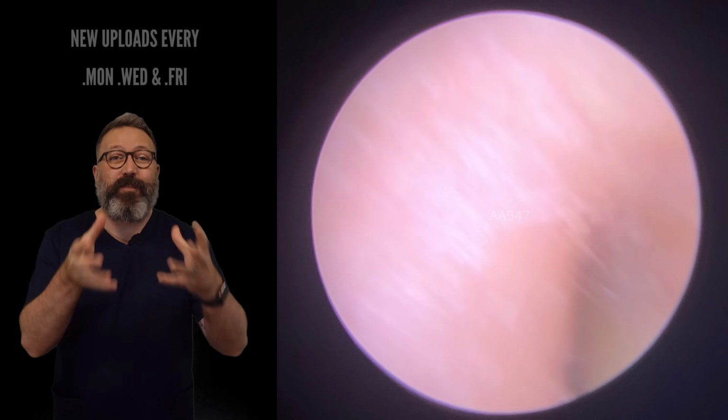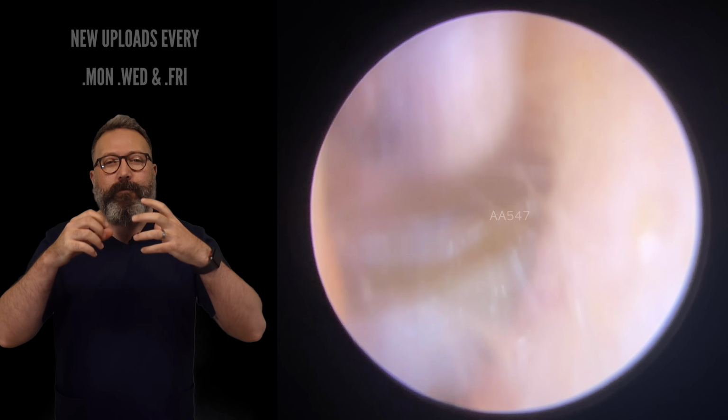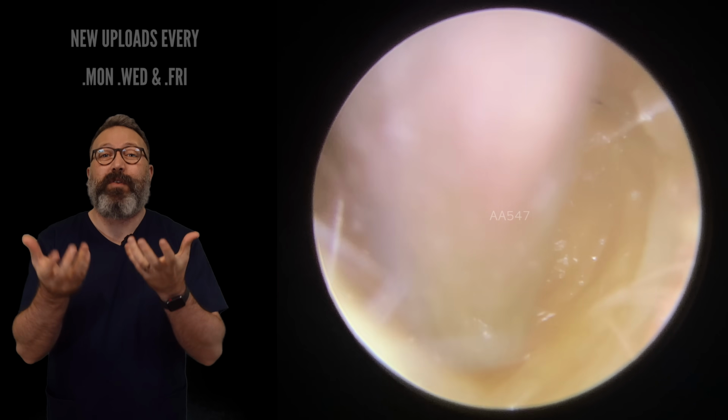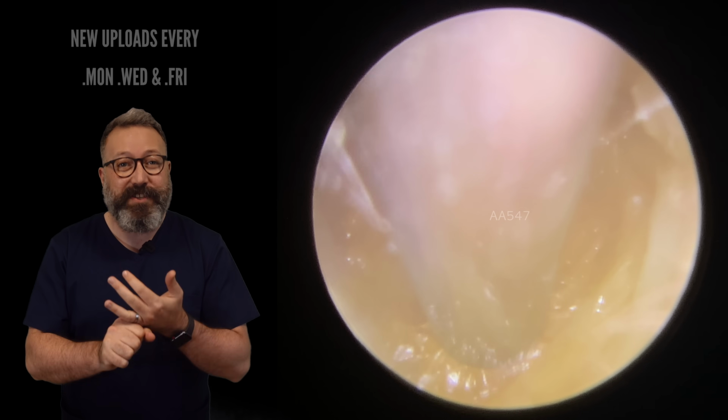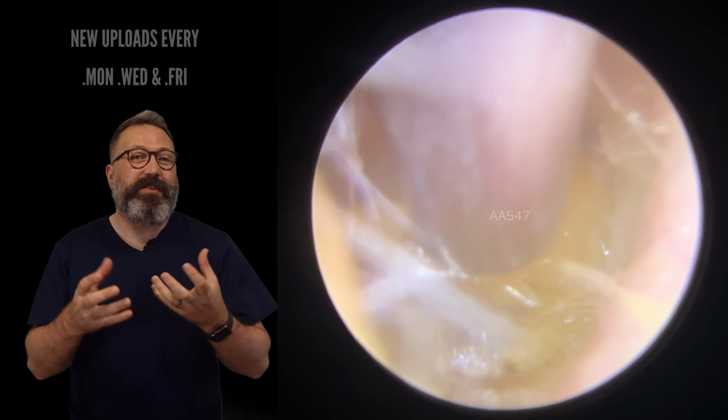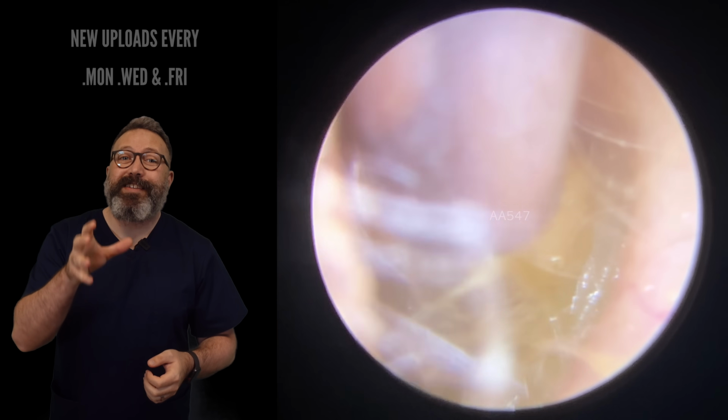Now you can see this first patient's ear canal here, very light in colour, with this sort of debris in here, which is an indication of one or two things. Either it's going to be a lot of skin embedded in this, or the patient's used some bicarbonate or peroxide drops, which tends to bleach the wax. In this case, it's skin.